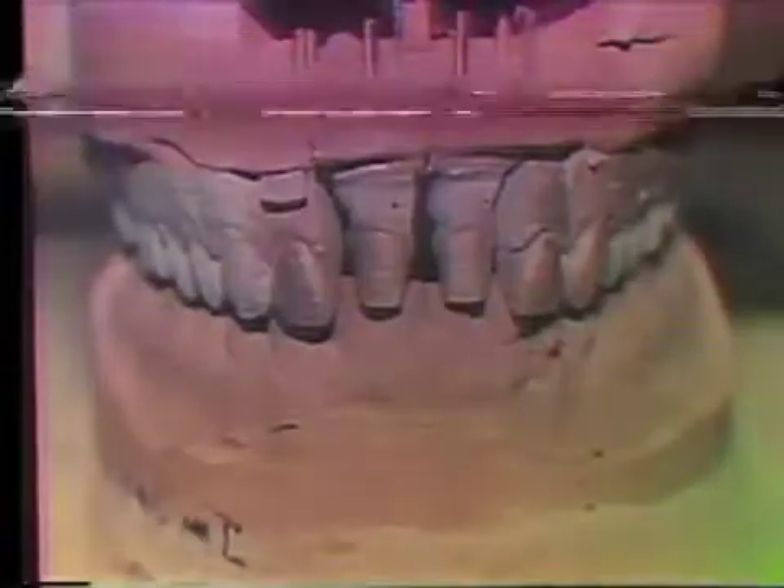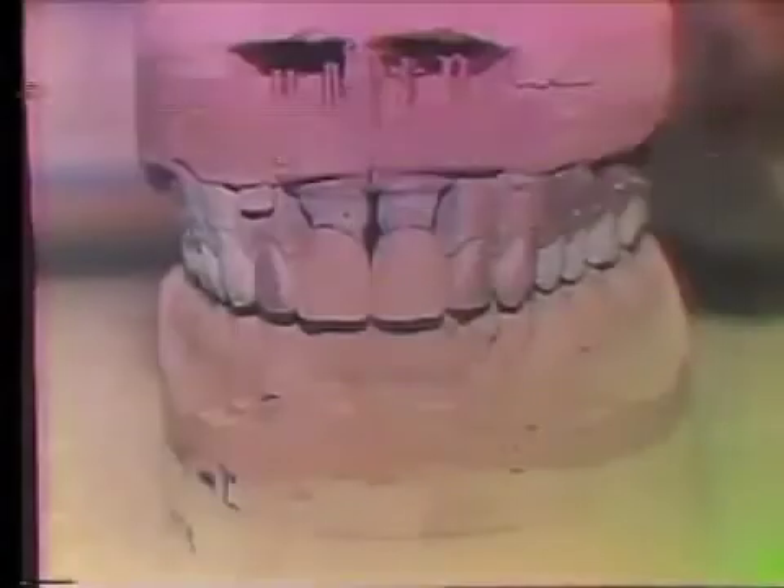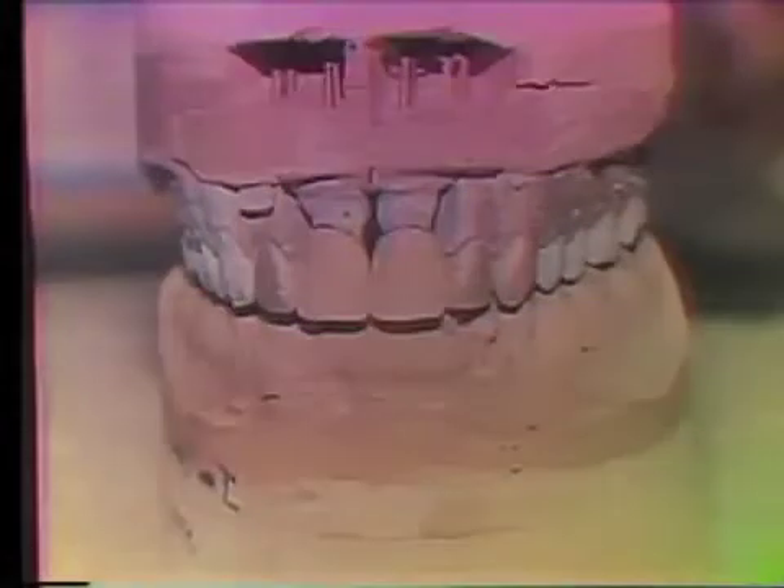After which time, the upper half of the pin setter is set back in its key position over the lower half, and the epoxy is allowed to harden for approximately 90 minutes. After this time, a stone base can be added, the dies are trimmed, the case is articulated, and sent to the lab. This whole process takes approximately 10 minutes, excluding drying time.